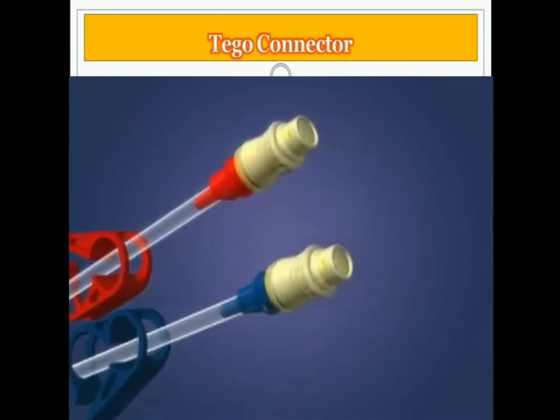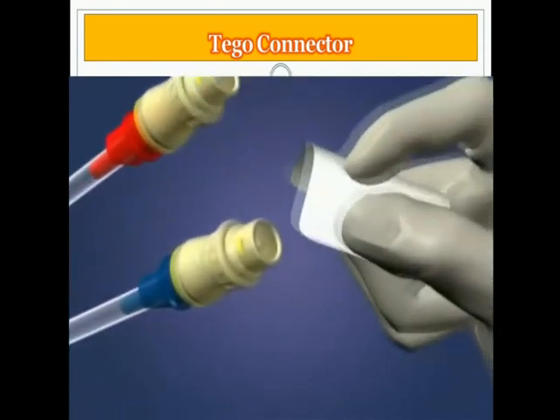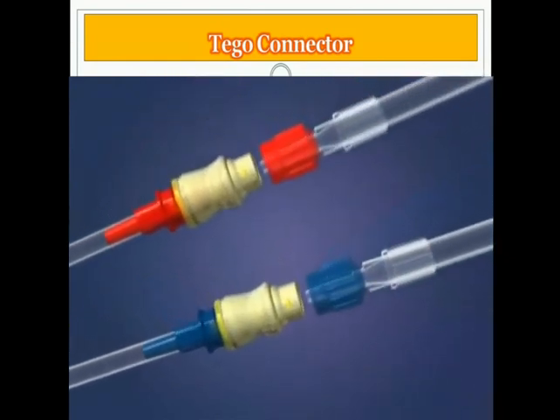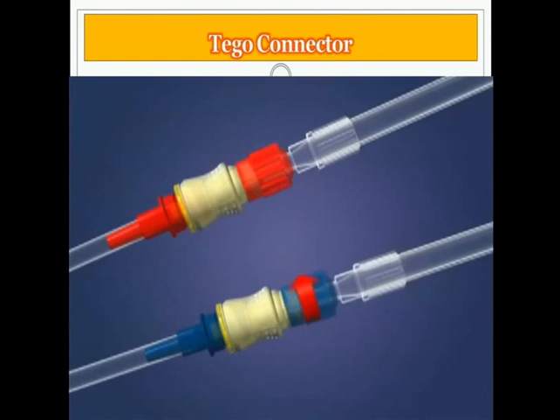To access the Tego, first swab the female luer with the desired disinfectant according to your facility protocol. Then attach the dialysis bloodlines or a syringe directly to the Tego. Push and twist the male luer of the administration device into the Tego until tight, then securely lock down the rotating collar.